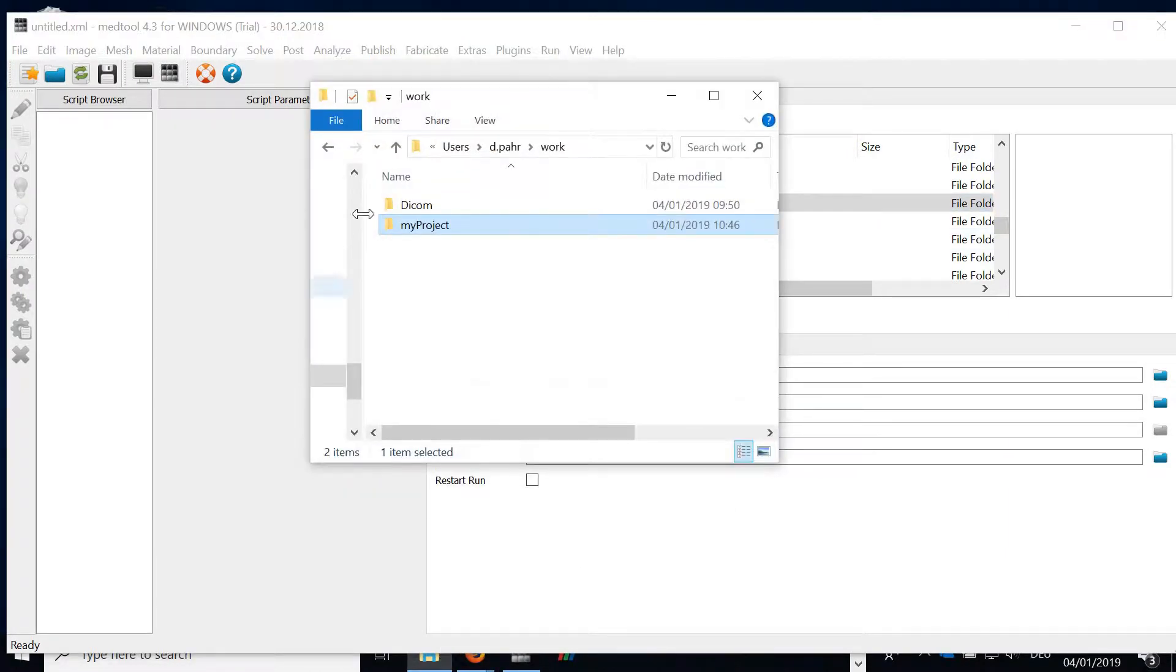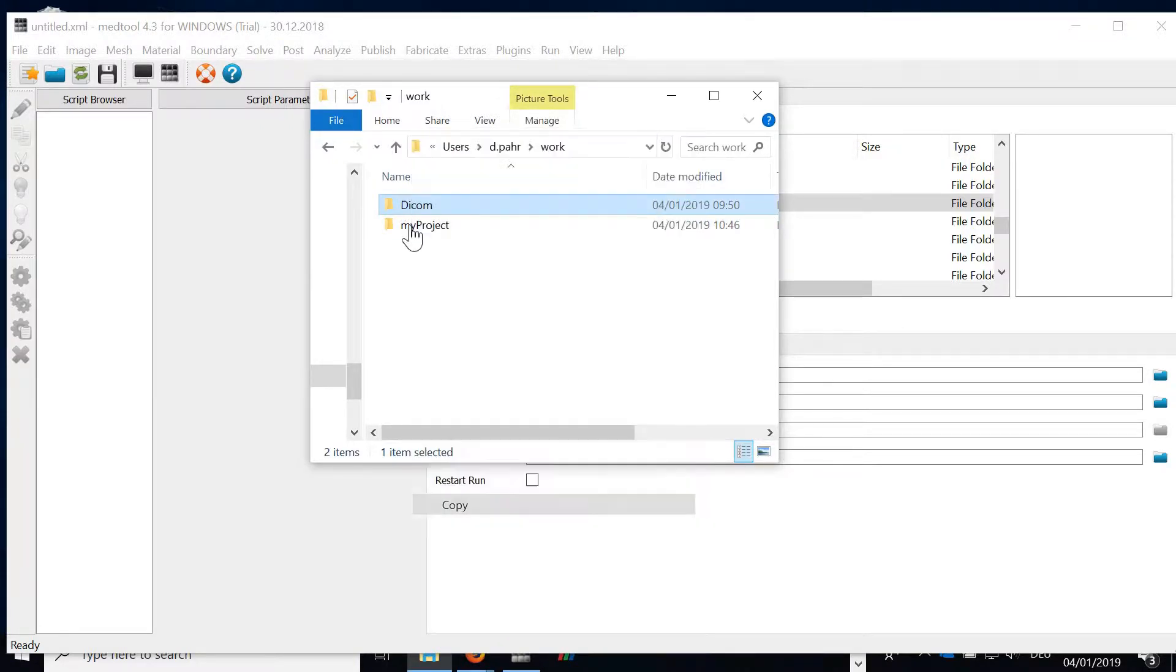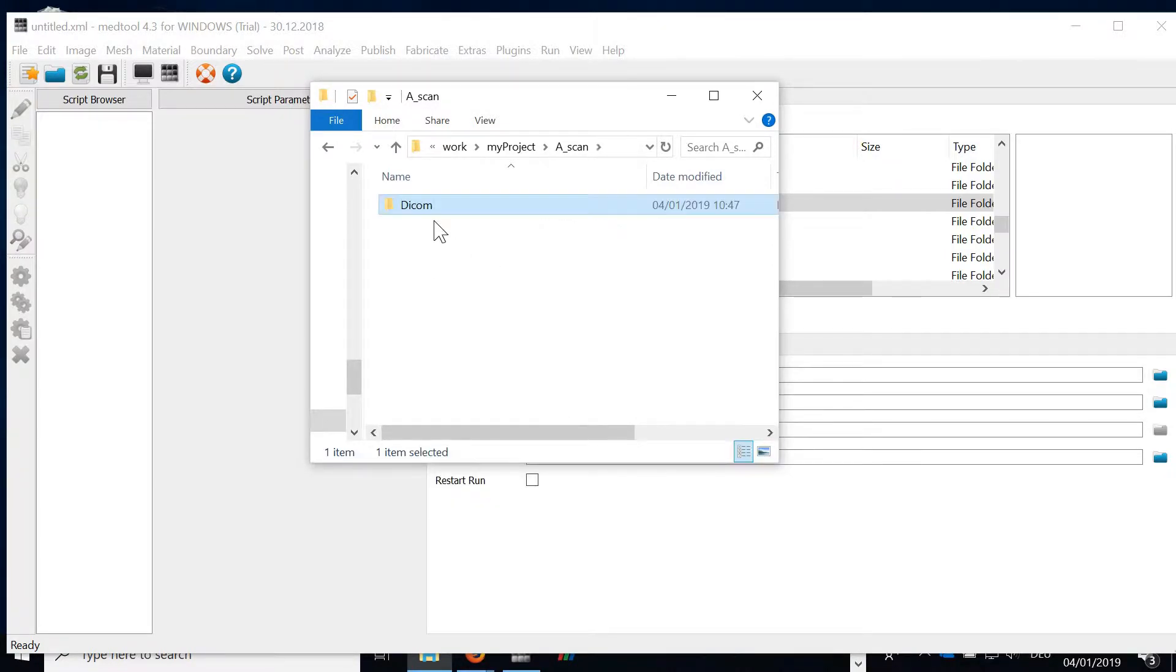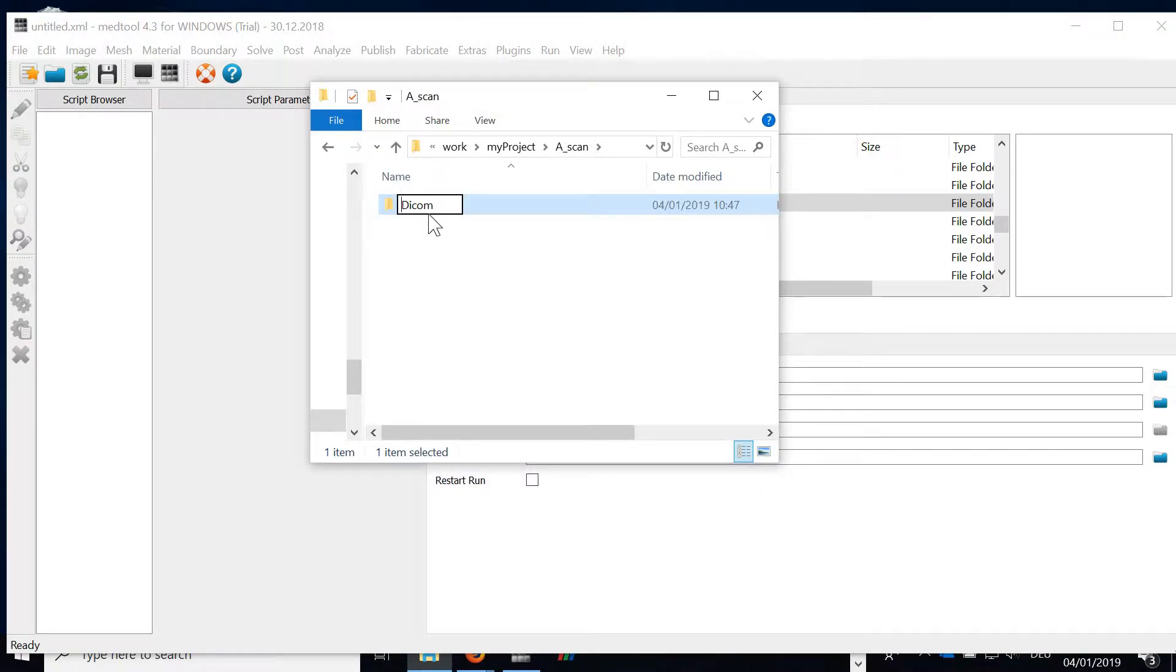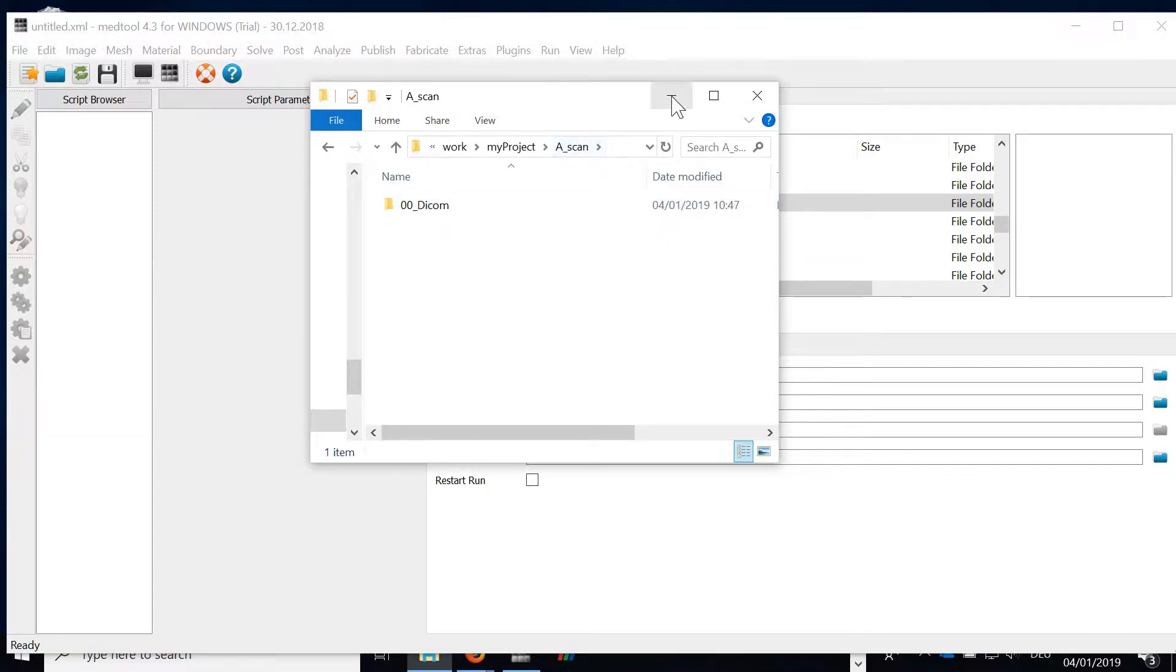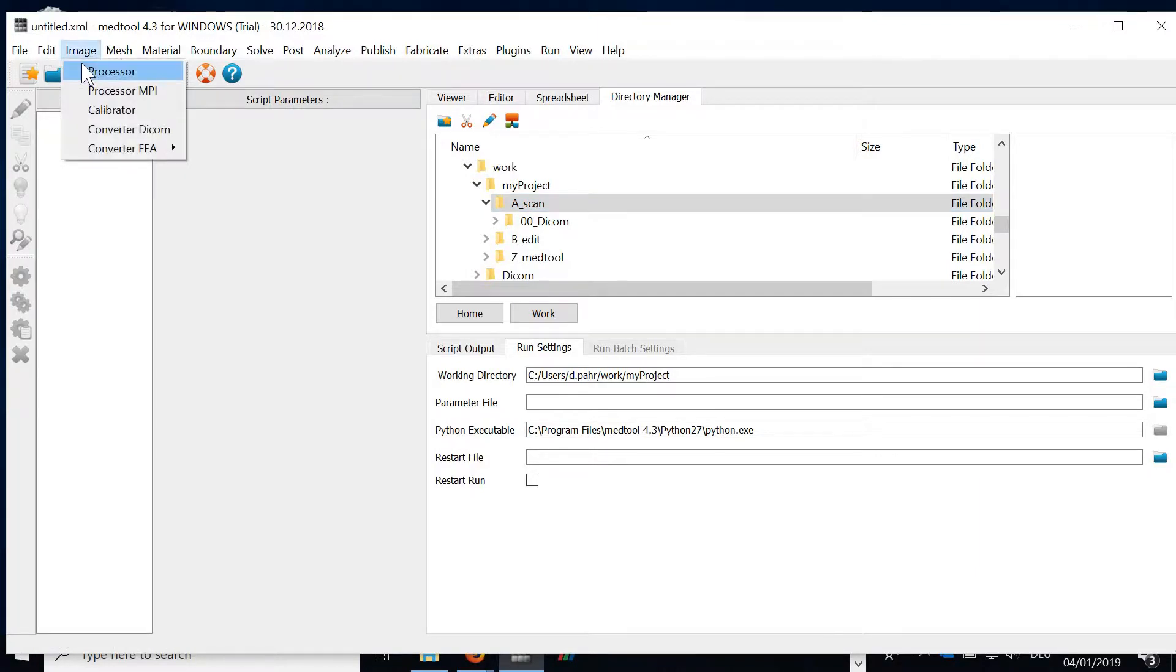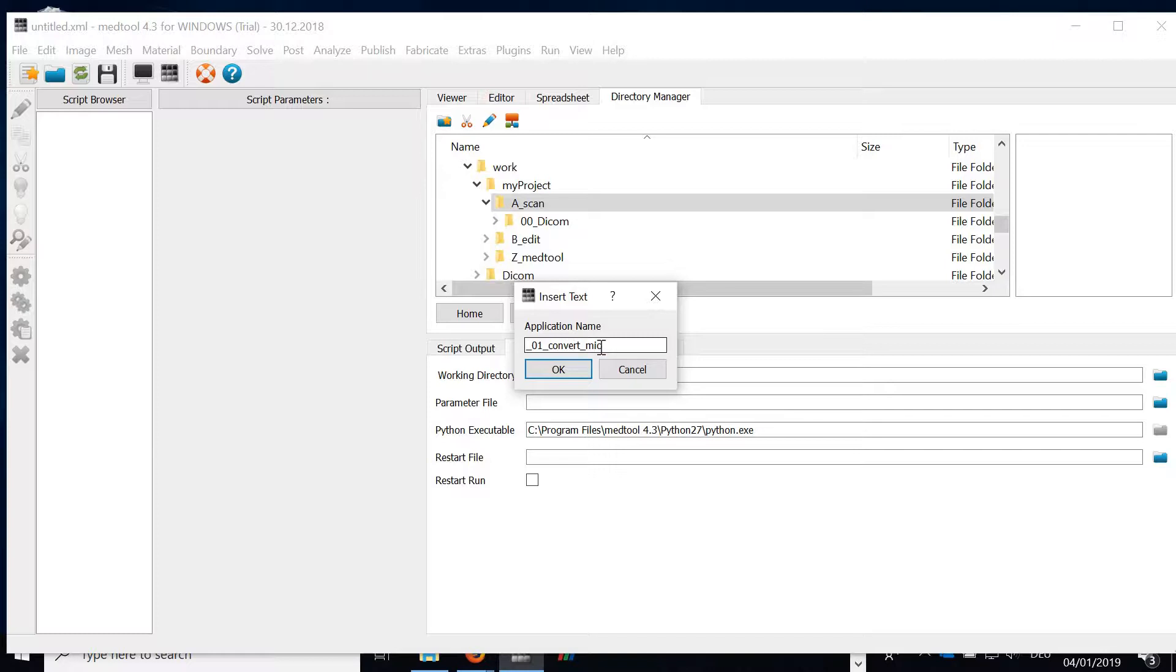Next what we will do is copy our DICOM data into this scan folder and I will rename it and give it the name 00 DICOM data. Next we'd like to convert the DICOM data to MHD format. Therefore we're using the image processor script and I give the script the name 01 convert. I call the script convert and I also keep MIC which means medical image converter in the name to know which script was modifying the data.